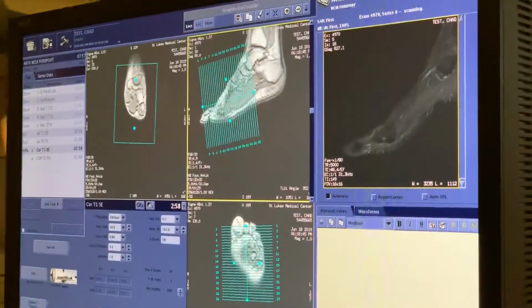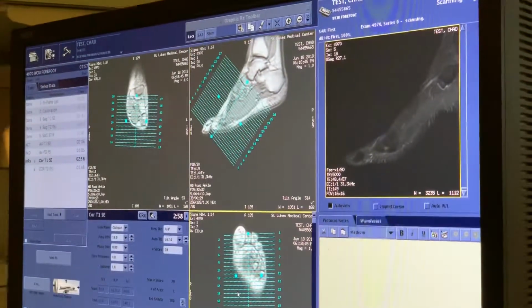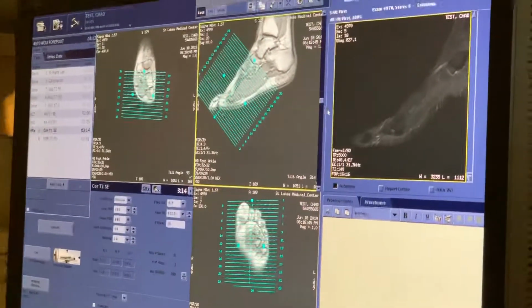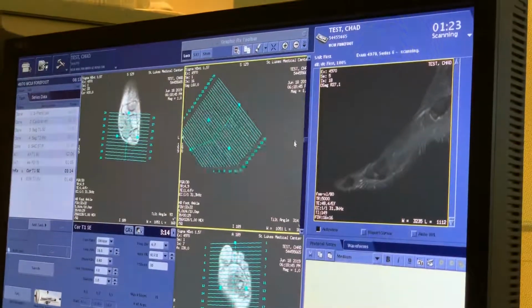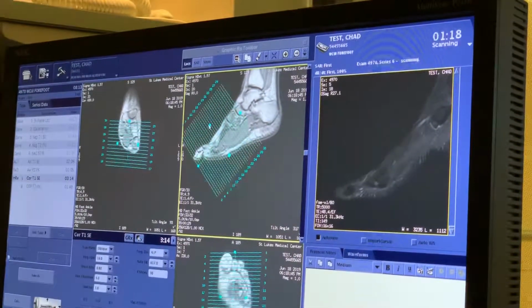Coronal's pretty straightforward. Same thing, we're going to angle with the metatarsal like that. I'm going to make sure that I cover the great toe in its entirety, and go out here. Again, I want to make sure that we cover that, especially if there's an infection of the great toe. Great toe is a very popular place to get an infection. I don't know if you guys knew that, but it is.